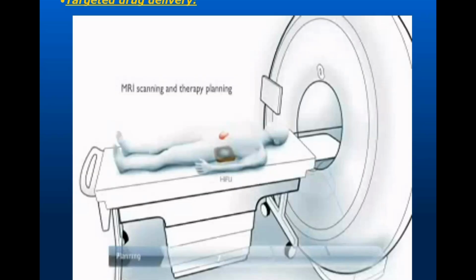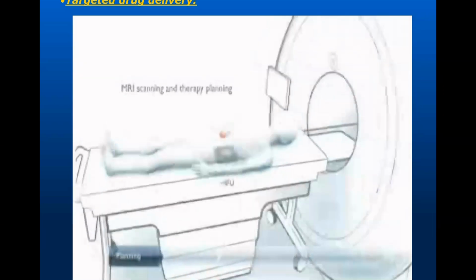And what happens is we start to heat the liver tumor, for example. And then when the liposomes reach the liver in this area, because it is heated, they start to be leaky and they will release the chemotherapy, while the other chemotherapy circulating everywhere else is not releasing anything. So we are minimizing the side effects. Let me show you this animation just to give you an orientation.